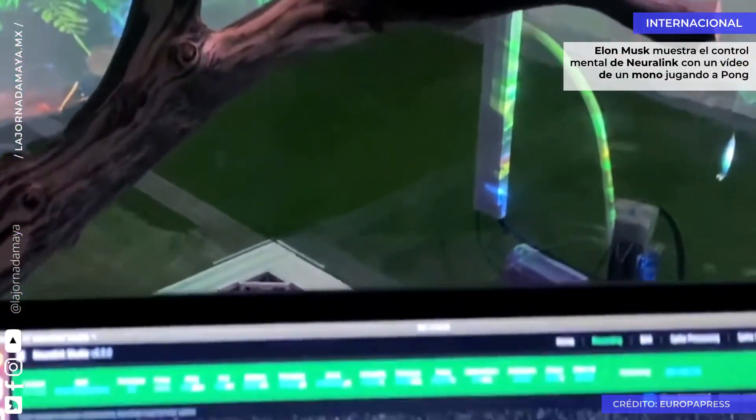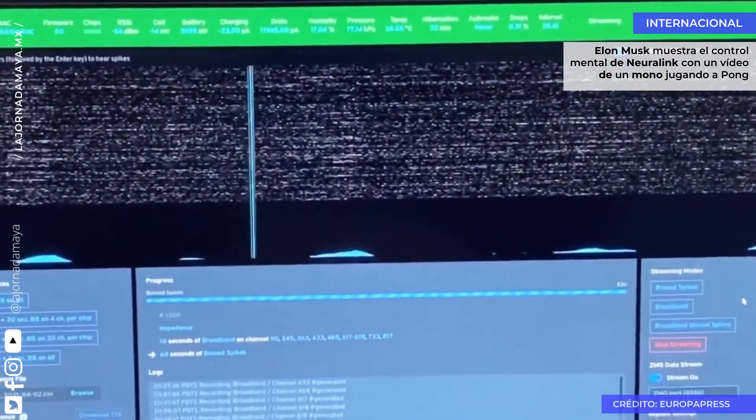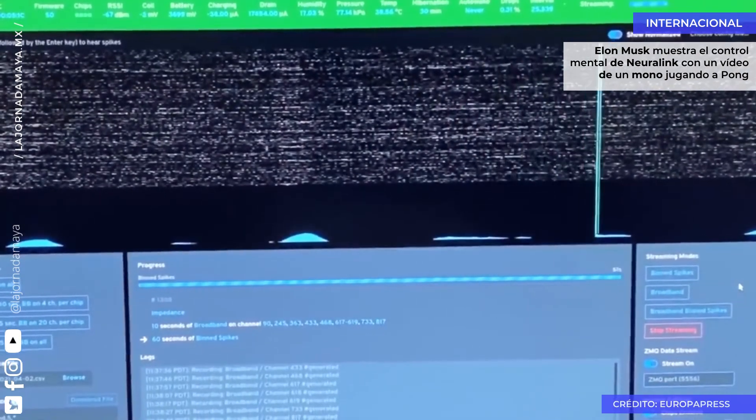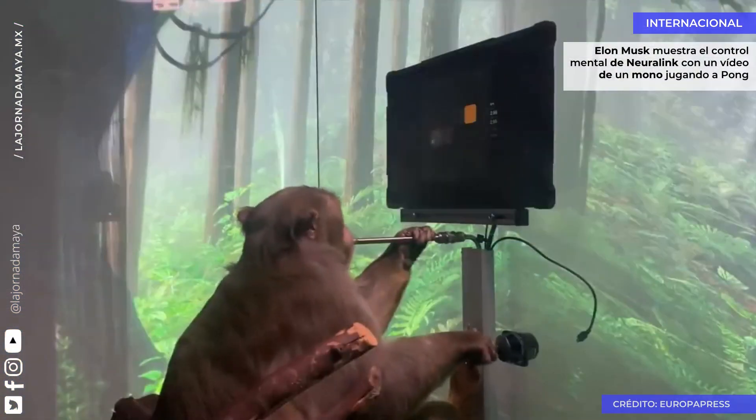As he's playing this game, we are wirelessly streaming, in real time, the firing rates from thousands of neurons to a computer. Using these data, we calibrate the decoder by mathematically modelling the relationship between patterns of neural activity and the different joystick movements they produce.